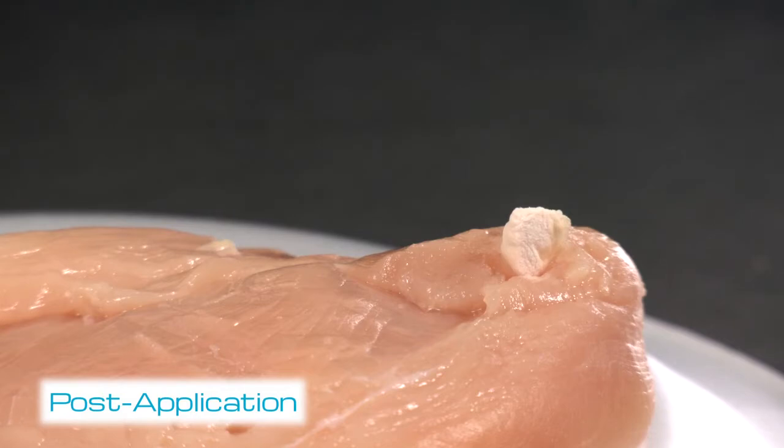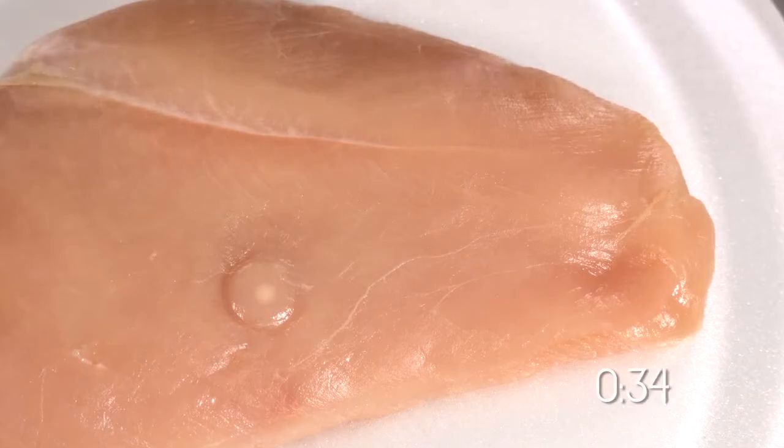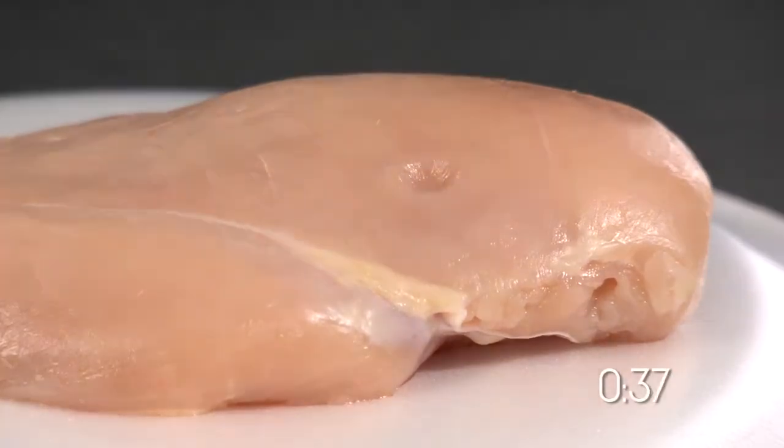A white ice ball should appear after a successful treatment and should take approximately 25 to 40 seconds to thaw naturally. Do not touch. Allow to thaw naturally.